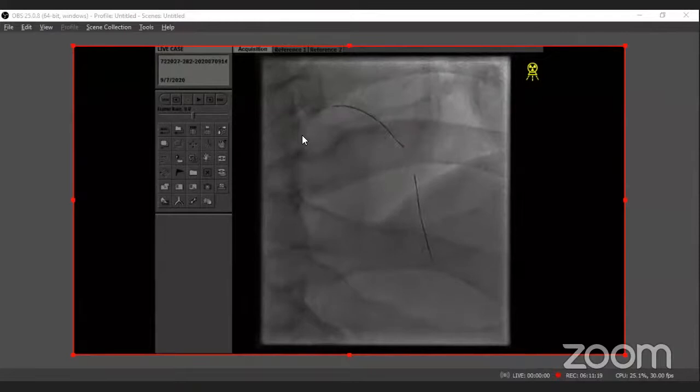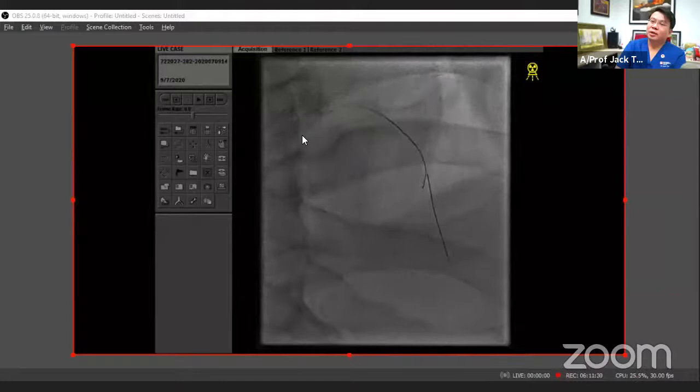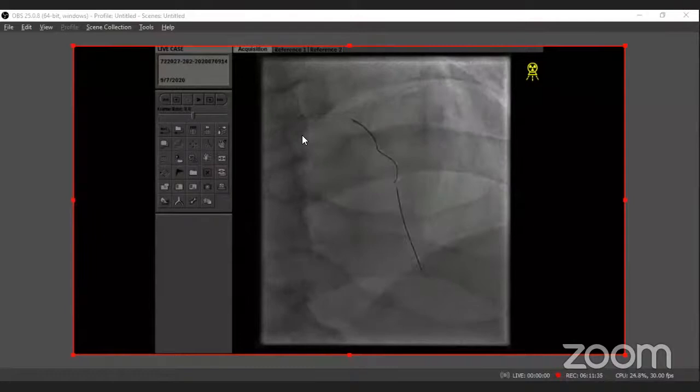Which stent struts does the wire go through? This is a little bit difficult because the wire is a bit damaged. So yeah, don't worry. We want to see you struggle. Okay, it doesn't turn. It doesn't turn. It went to a small branch.